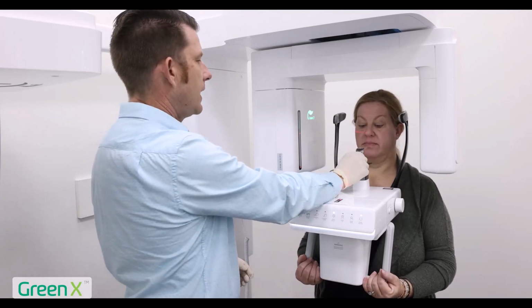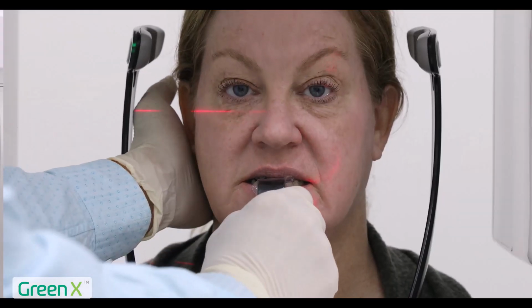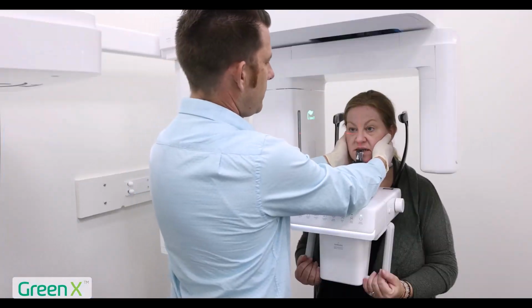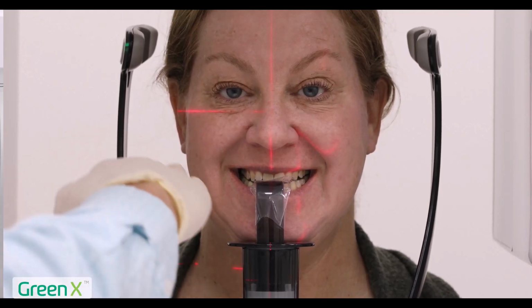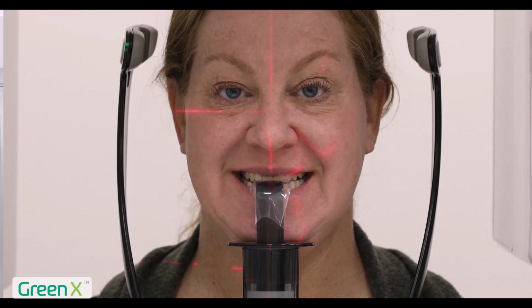I'm going to have you go ahead and open and bite on the bite stick. I'm going to ensure that the patient's chin is firm on the chin rest. Next, we are going to line the patient up center. Smile really big for me. We're ensuring the occlusion is tipped down about 10 degrees, or that natural head position.